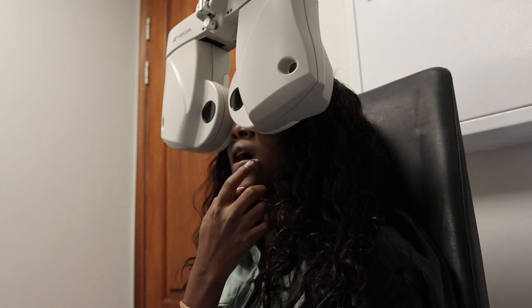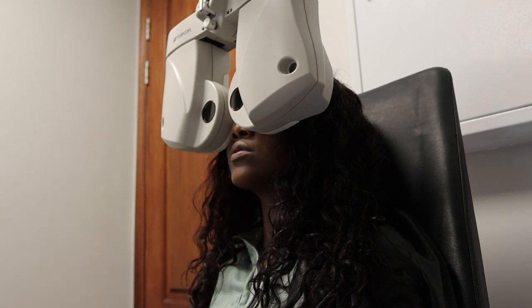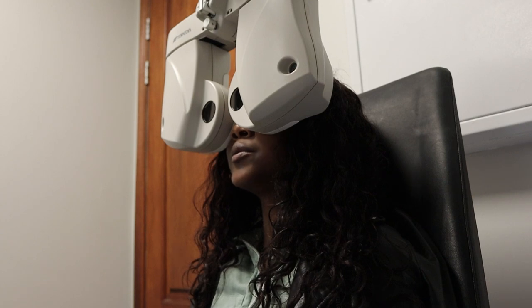Those letters there, are they slightly clearer lens 1 or 2? 2. Clearer 3 or 4? Repeat for me again, please. 3 and 4. I think 3. Clearer 5, 6? Feels the same. And 7 or 8? Feels the same. Clearer 9, 10? 10. And 1 or 2? Please repeat that. That's 1 and that's 2. 1 felt clearer.